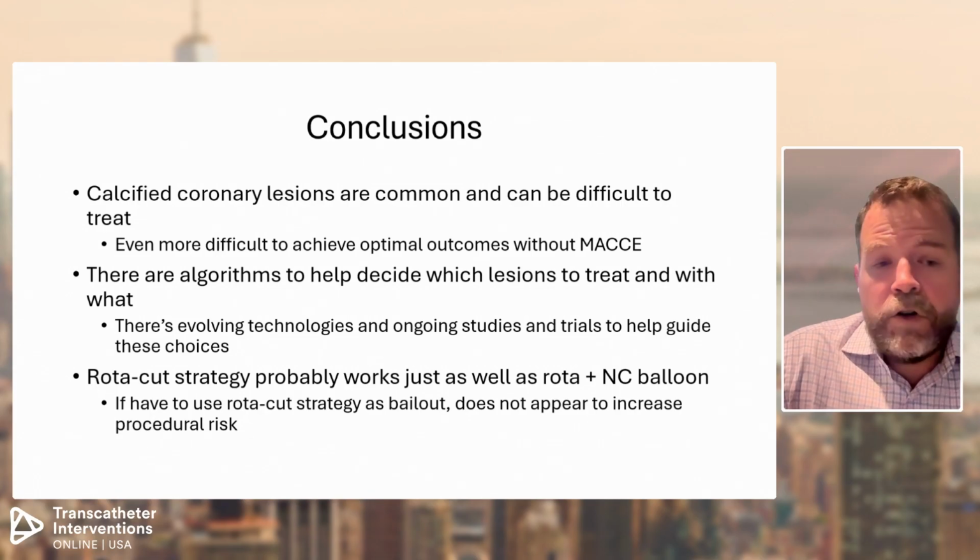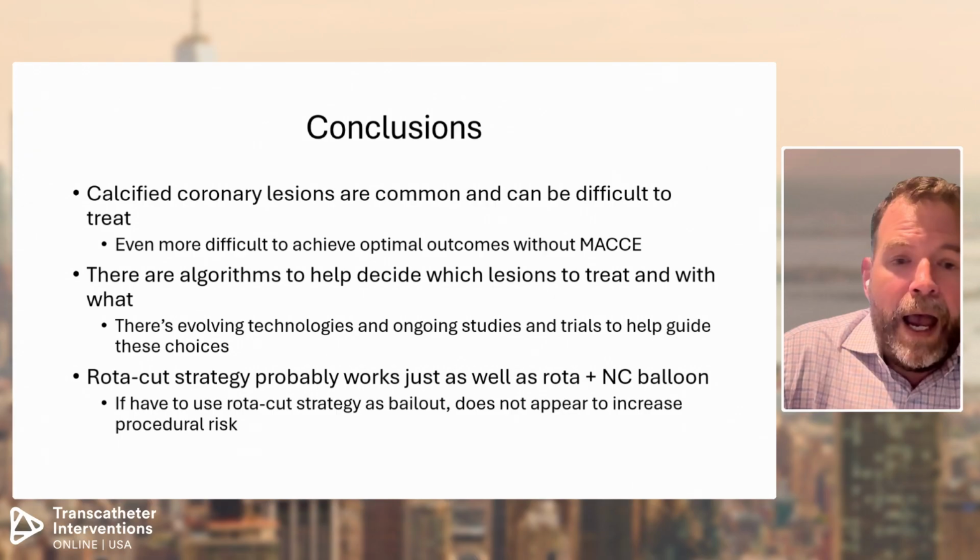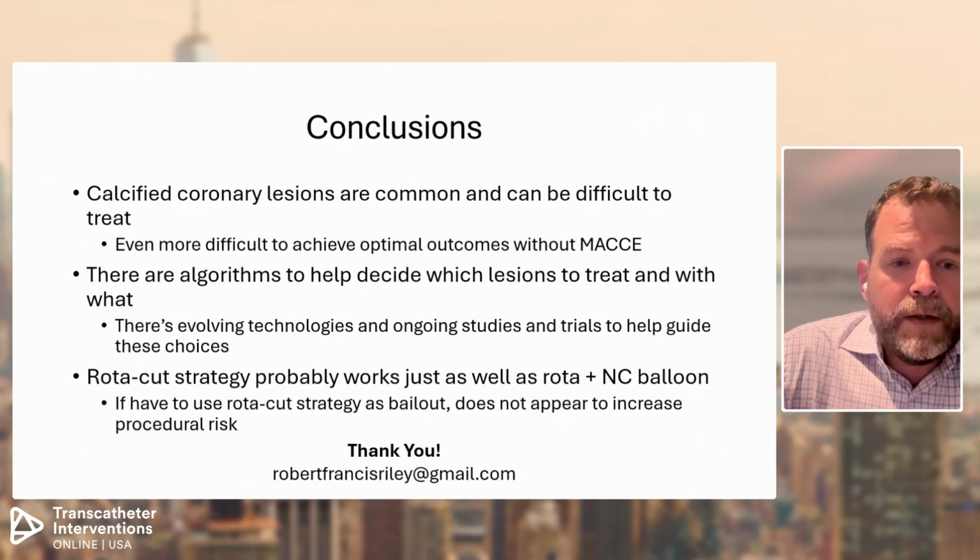The rotacut strategy works just as well as rota NC balloon, but it means that if you have to use it as a bailout, it doesn't increase procedural risk.